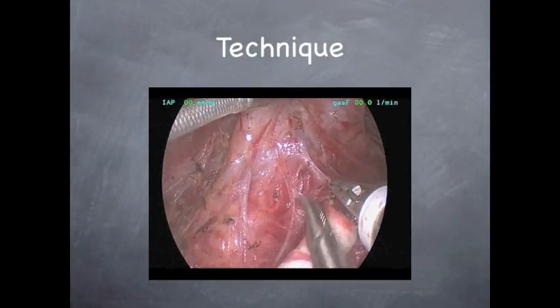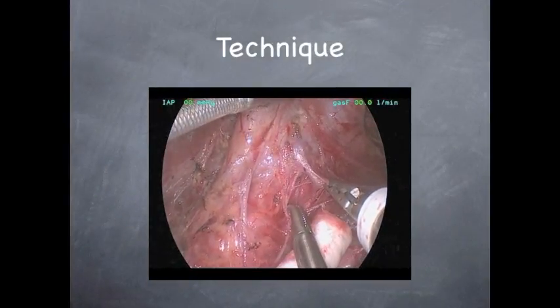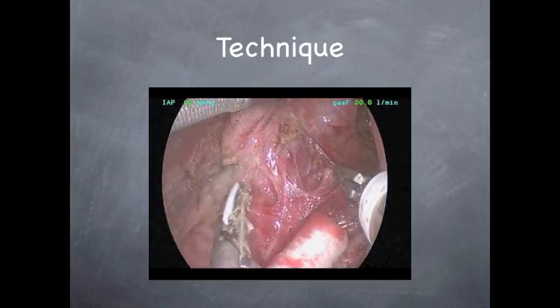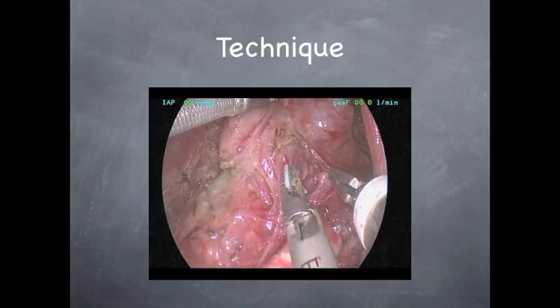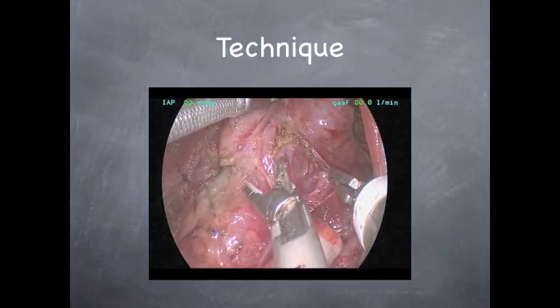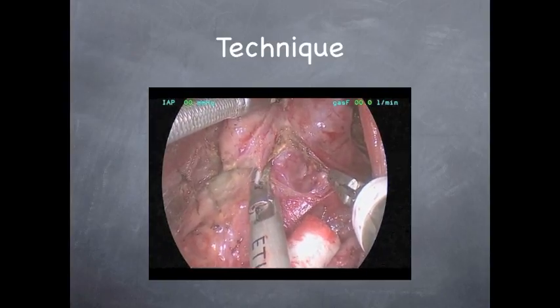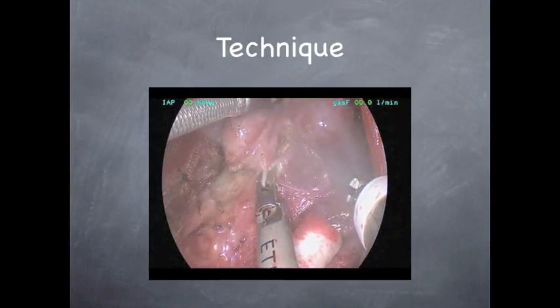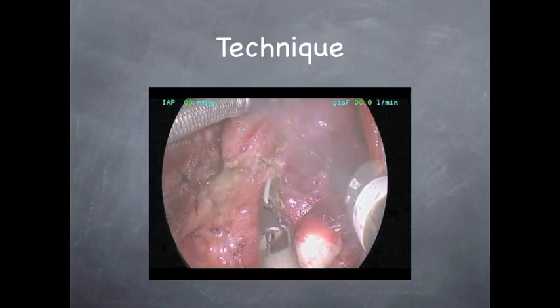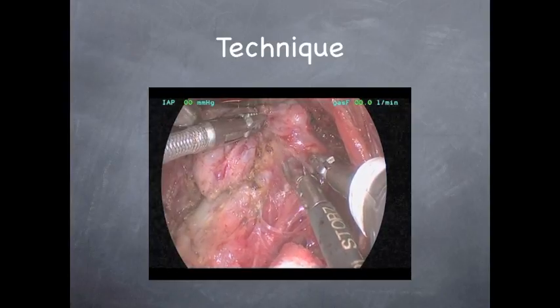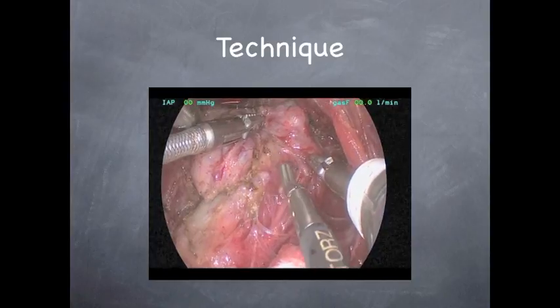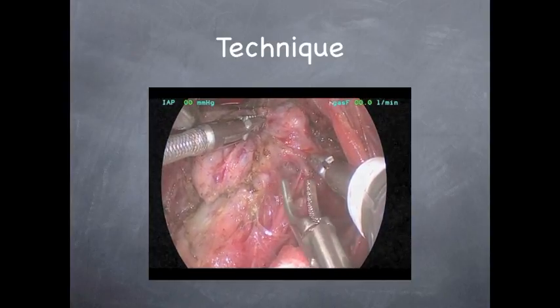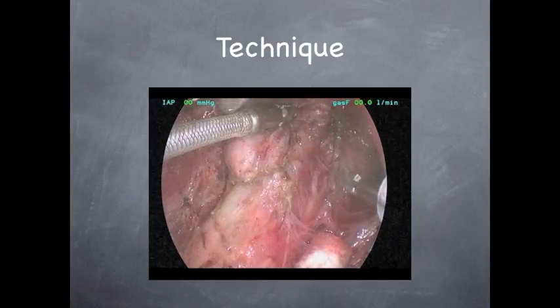This short video clip shows you the view that the surgeon sees during the operation. The thyroid gland is located at the top of the screen. This instrument is called the harmonic scalpel and is being used to divide and coagulate tissue. Here, the thyroid gland is being mobilized from the trachea. The recurrent laryngeal nerve, or the nerve to the vocal cord, is being dissected from the thyroid gland. You can hopefully appreciate the magnified view that is offered to the surgical team, and this assists the surgeon in identifying and preserving the pertinent anatomy.